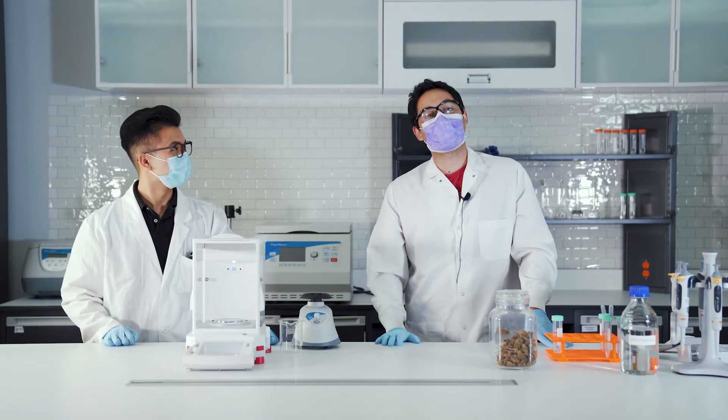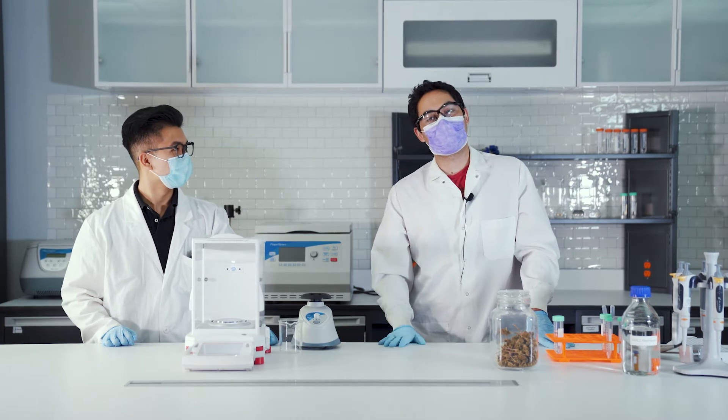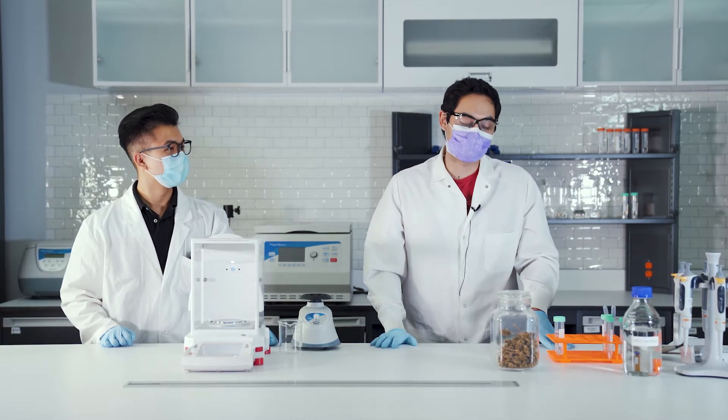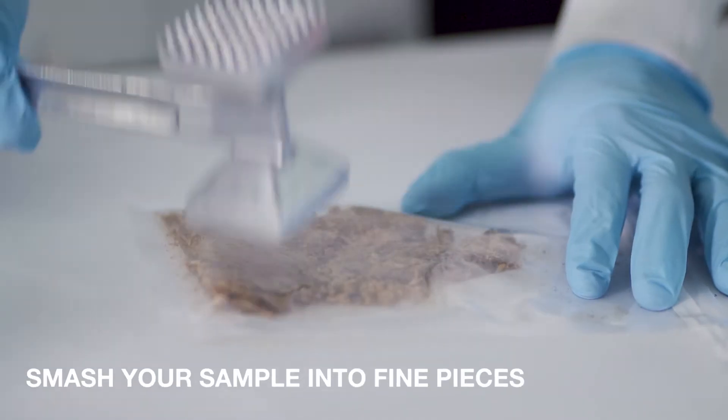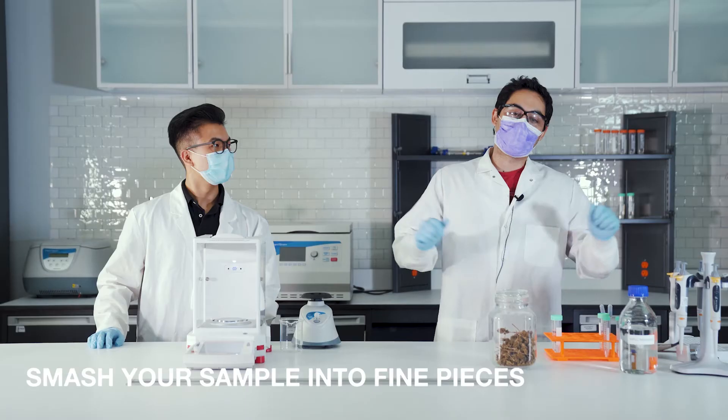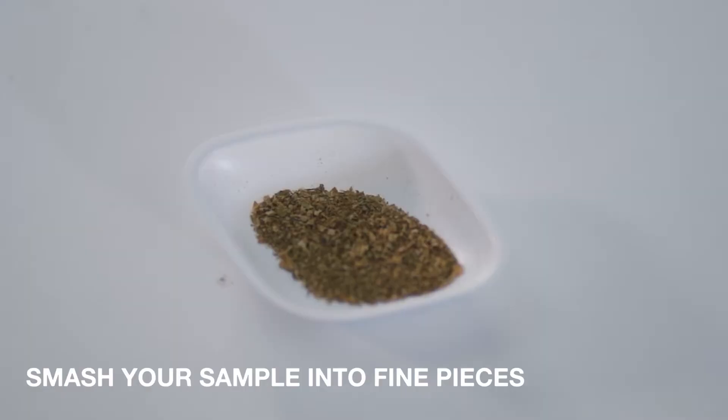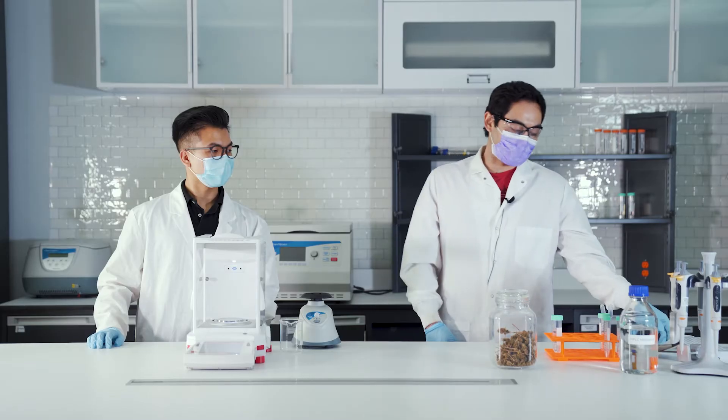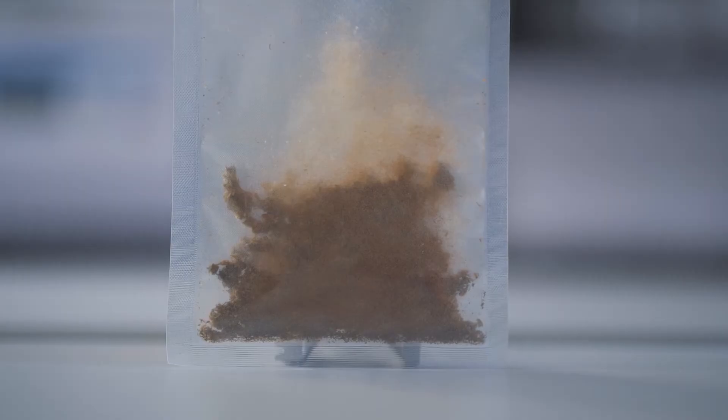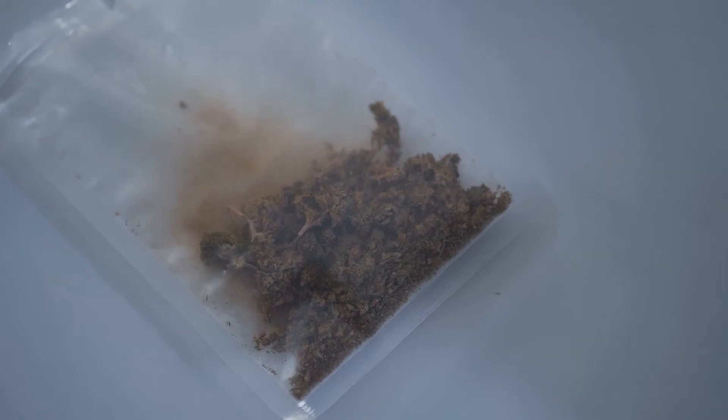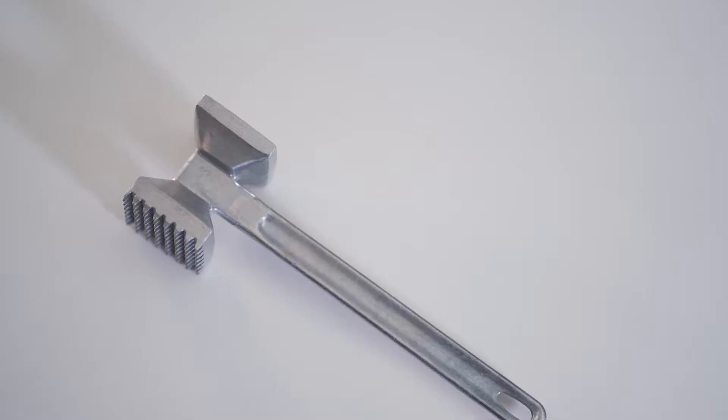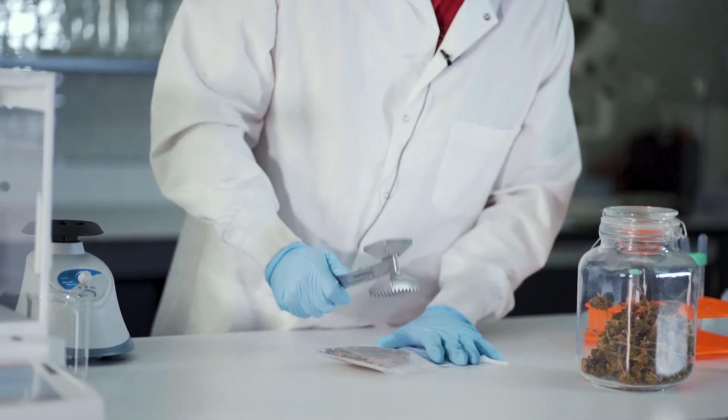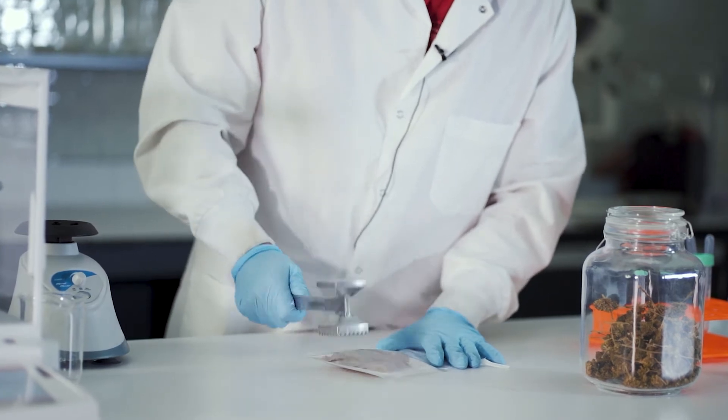The first thing you would want to do when testing for cannabis is you'd want to homogenize your sample. That means you want to smash it into little pieces so no matter what you sample, it's a good representative sample of the batch. What we've done here is you can take a bag, put sample in there, freeze it, and then if you have a mallet you can smash it up until you get a nice fine powder.